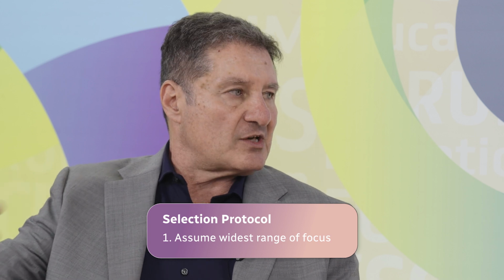Let's start with how we classify patients and match their daily needs to the right IOL design. Starting from the point of view that the more range of vision you provide the patients, the happier they will be, in our practice we start from the concept that we consider a patient a good candidate for the widest range of focus unless proven differently.